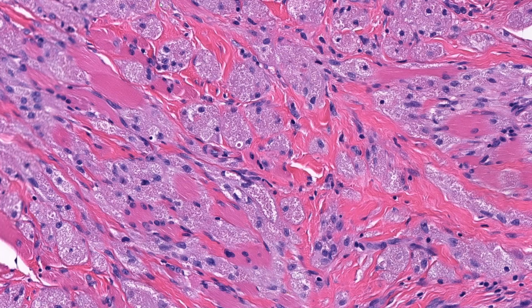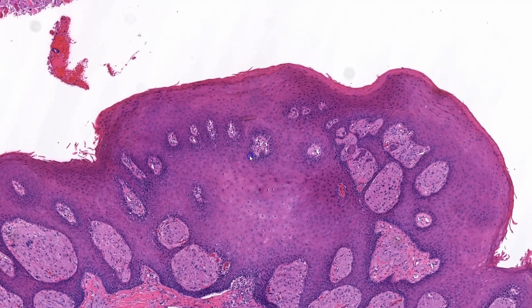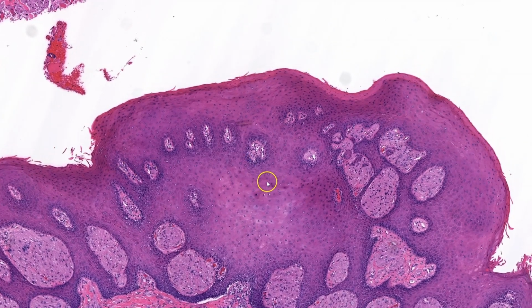An important pitfall is that some cases can induce pseudoepitheliomatous hyperplasia in the overlying epithelium, which can mimic squamous cell carcinoma, especially in small superficial biopsies. For example, if you got the very top of the specimen, like right here, you might see the thickened epithelium and the parakeratosis and maybe think this is a squamous lesion and overlook these unusual cells in the dermis.